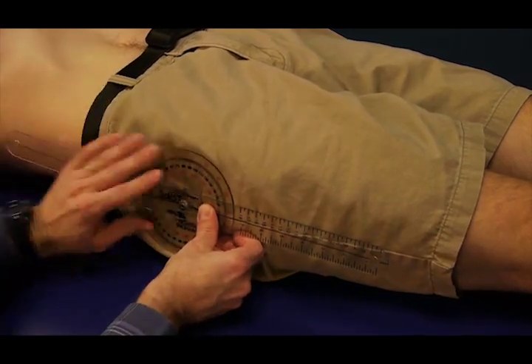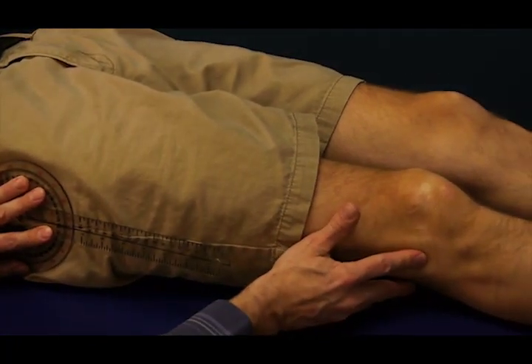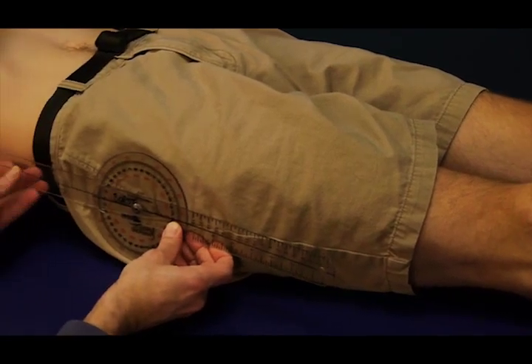The moving arm is lined up with the lateral epicondyle of the femur. That's the starting position.